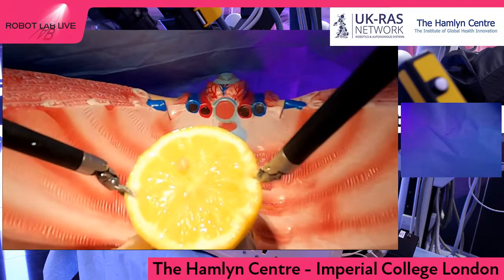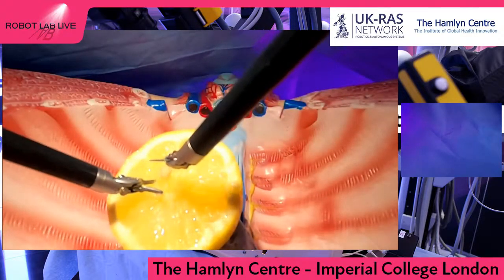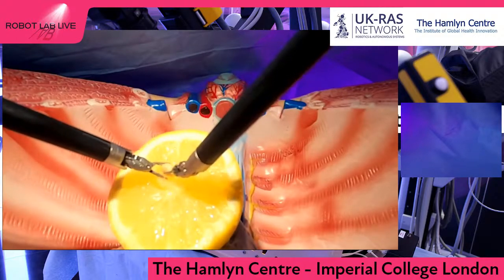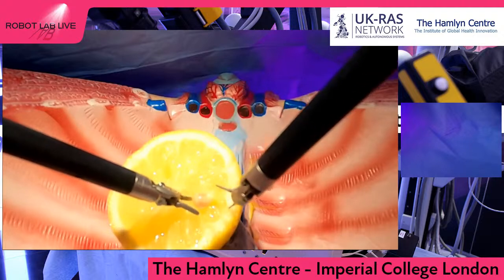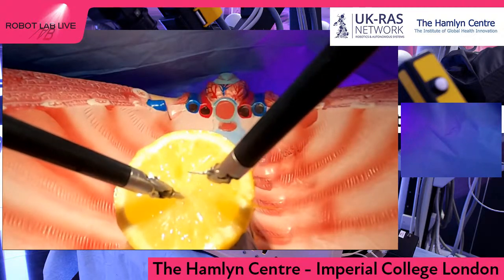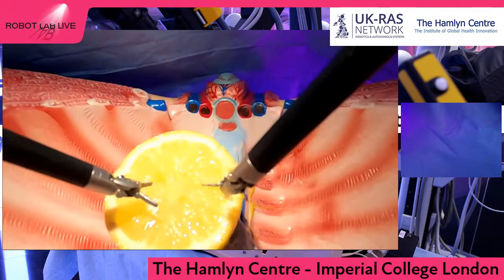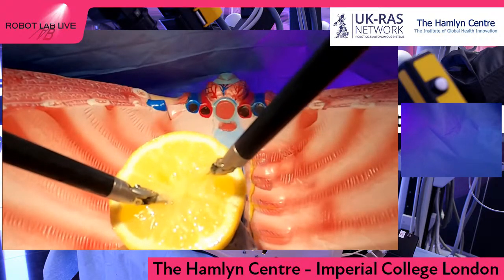And lastly, I wanted to talk about one last example, which would be the case of the tools. As you can see, these tools manipulating the lemon have some wrist and they can do some movement, but they're quite stiff, right? And they are not like the surgeon's hands, that are soft, gentle with the tissue, and compliant. And so we're also working on new tools that will be soft and more like what we're used to. They will be more like our hands.